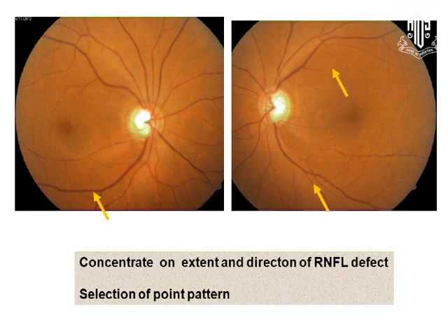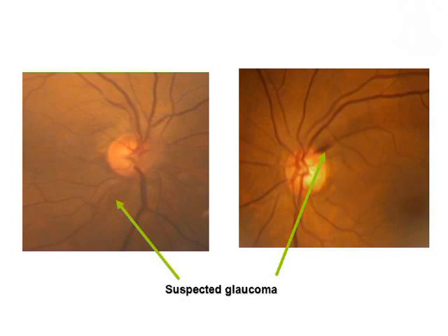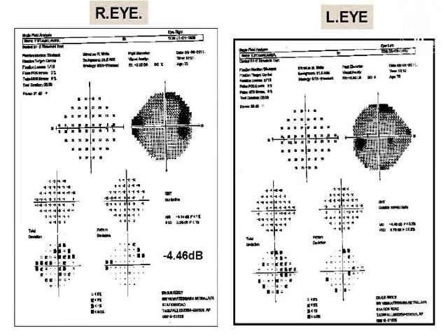When the 10-2 was taken, see, almost in the left eye it has started here, with a mean deviation of -18. So it is very unusual. Almost the patient is becoming blind, whereas in 24-2 it is not looking advanced. So you can't grade glaucoma just on the basis of mean deviation.